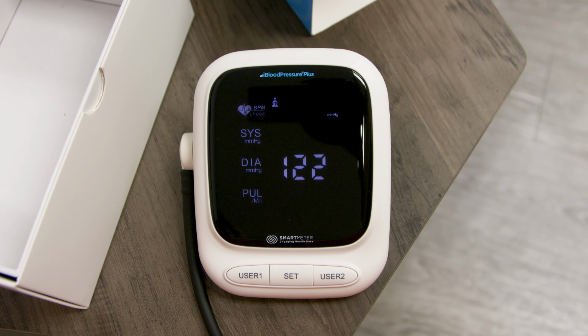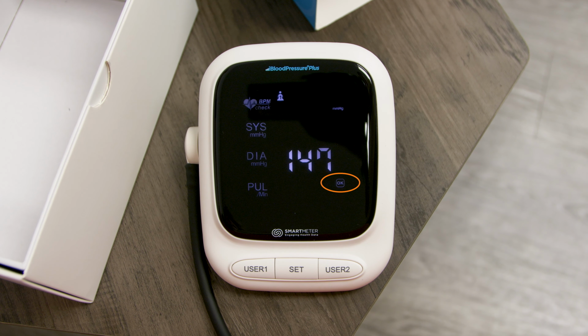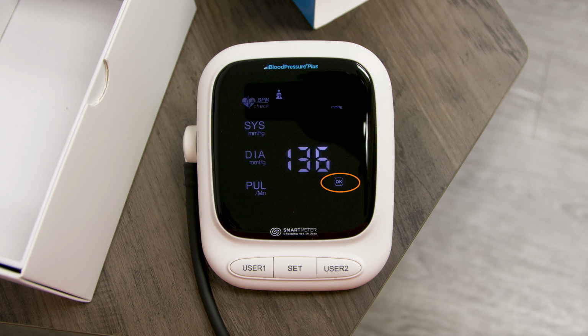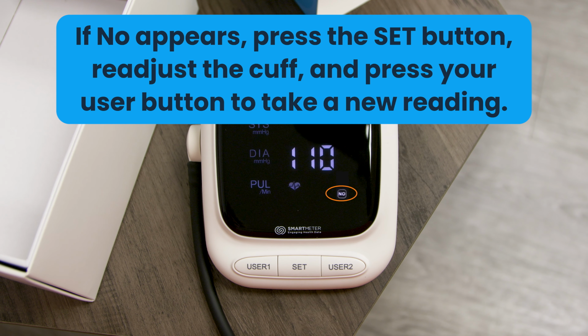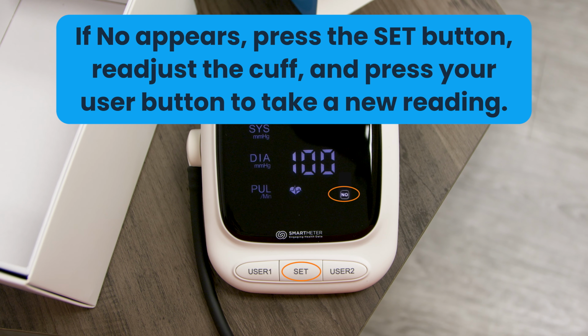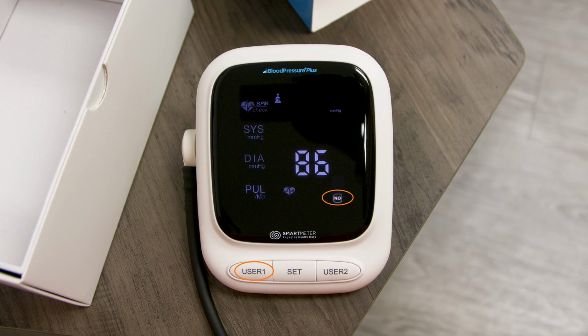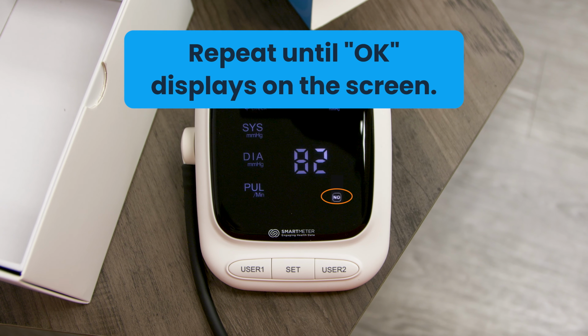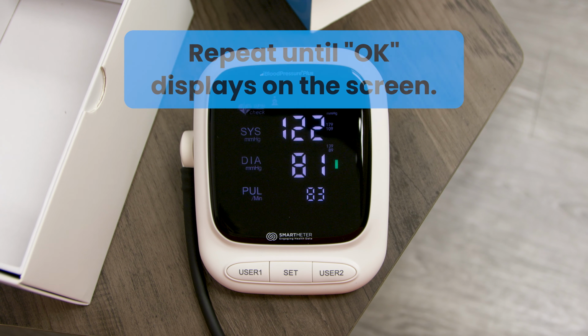If the arm cuff is applied correctly, the screen will display OK below the diastolic number and will continue to take your reading. If adjustments are needed, No will be shown. Press the Set button once, readjust the cuff, and press your user button again to take a new reading. Repeat as necessary until the cuff is properly adjusted and OK appears on the screen.